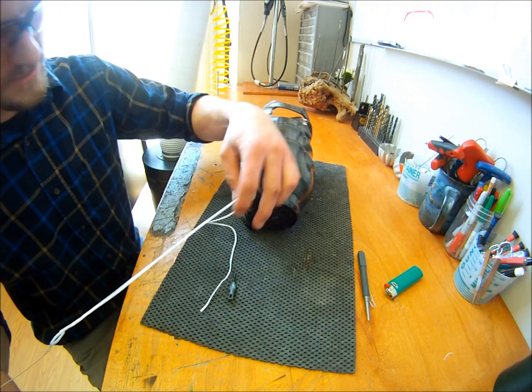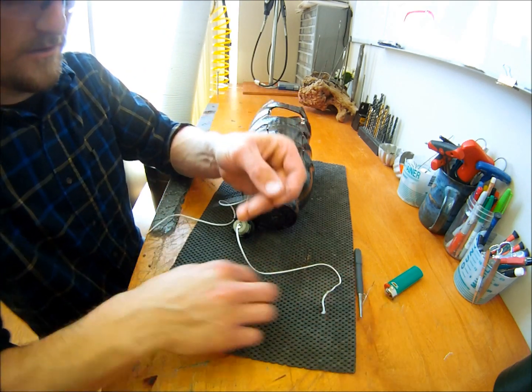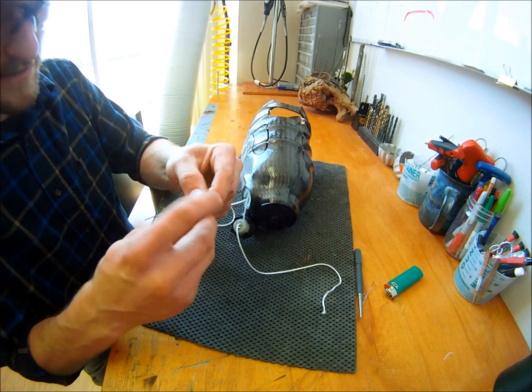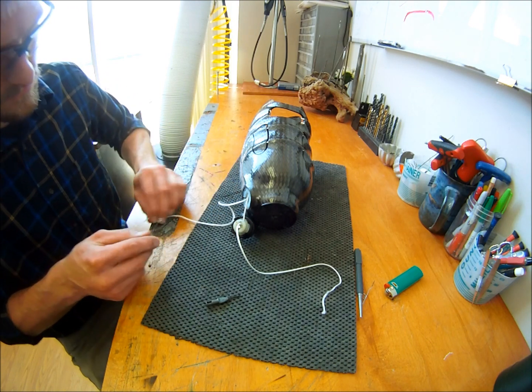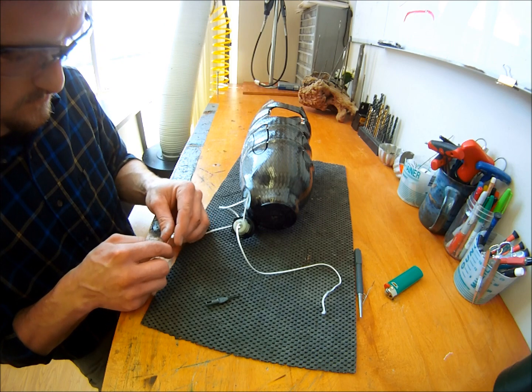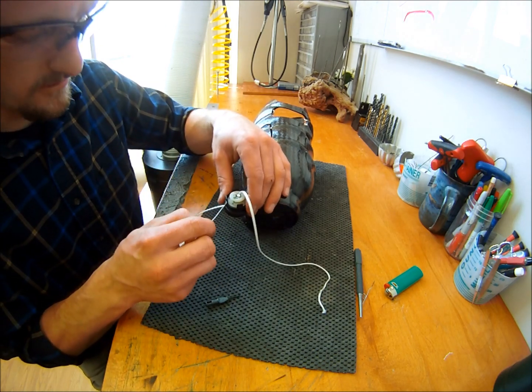Pull it through the base. And at this point you may need to open up the eye in the feeder again. And repeat the same for the other side.